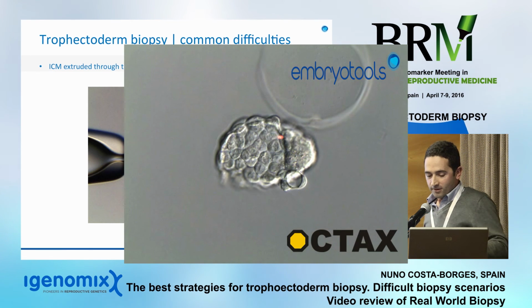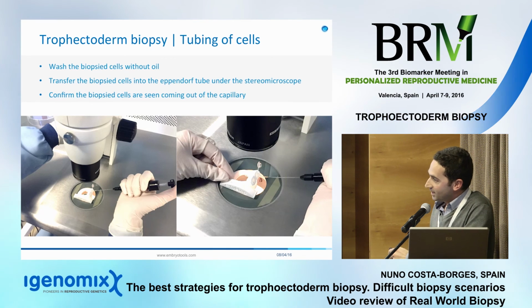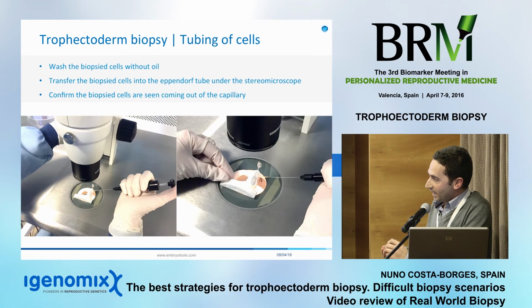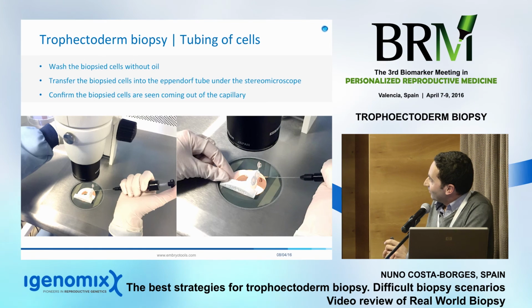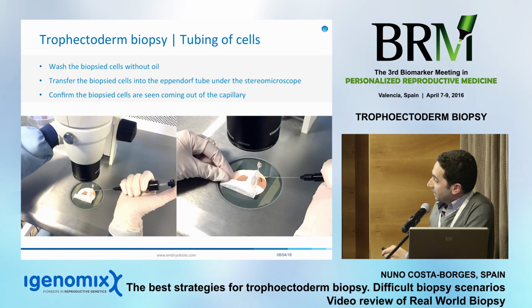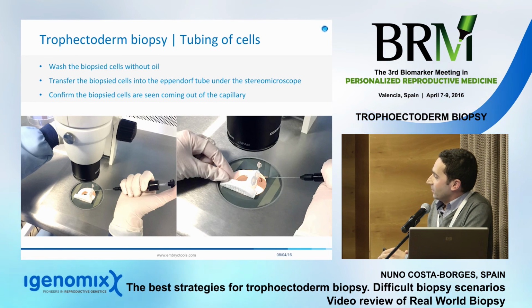So the last thing is the tubing. That is also important because we can do everything correctly, but then at the last moment, if we don't place the biopsied cells correctly in the Eppendorf tube, it's like if we haven't done anything. And for doing this, we normally wash the cells in droplets without oil. I'm not sure if Maria Eugenia can tell us if it's really necessary or not.